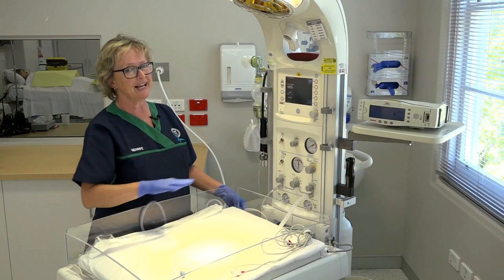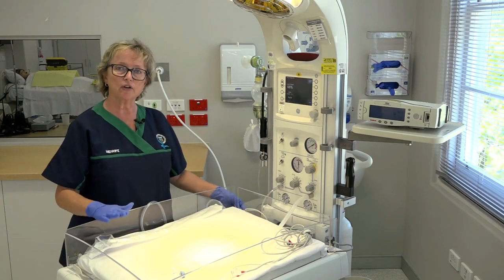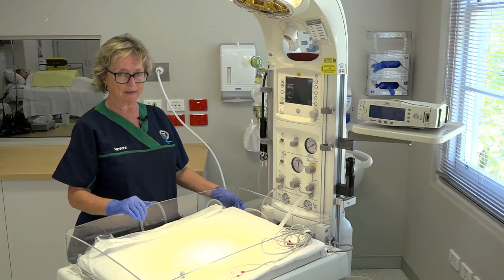You'll notice when you turn it on it has an inbuilt scale, but during a resuscitation it's not the time to be weighing your baby.